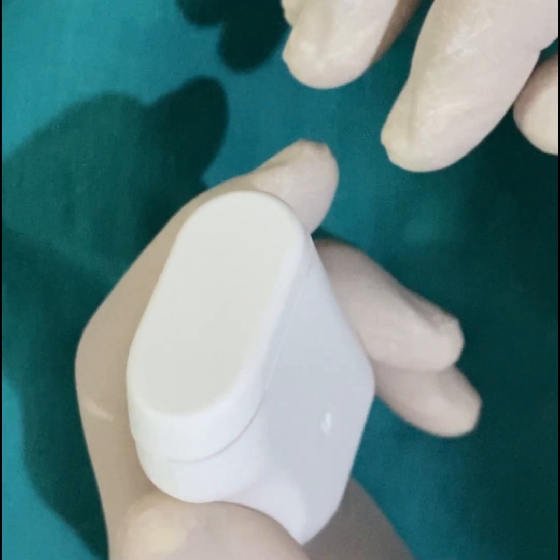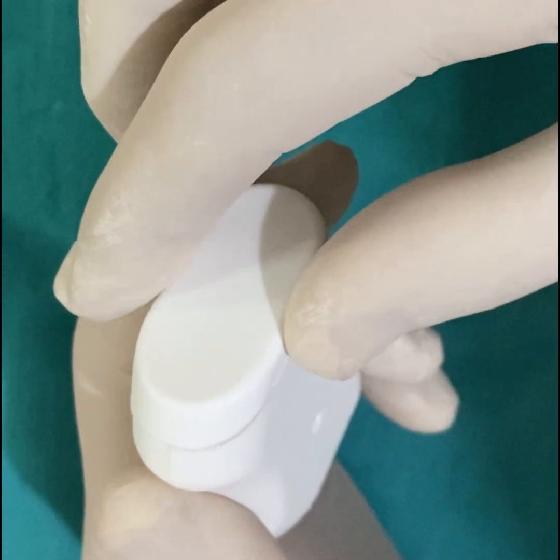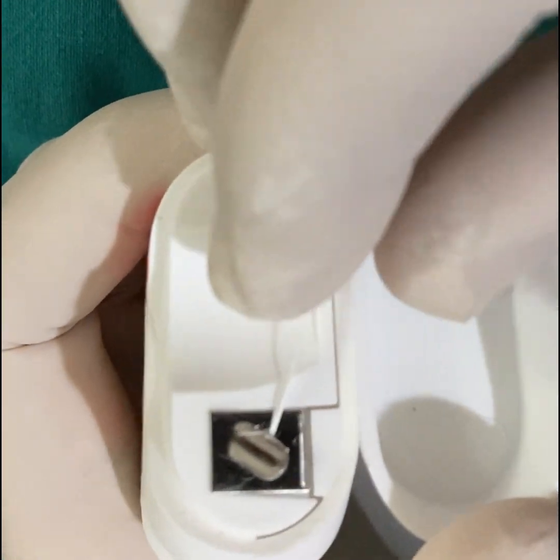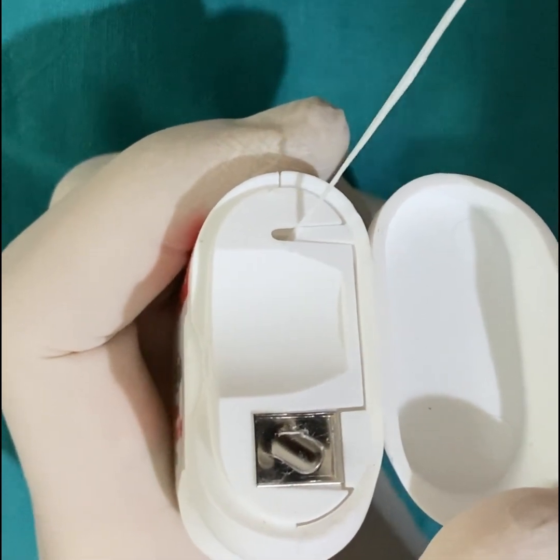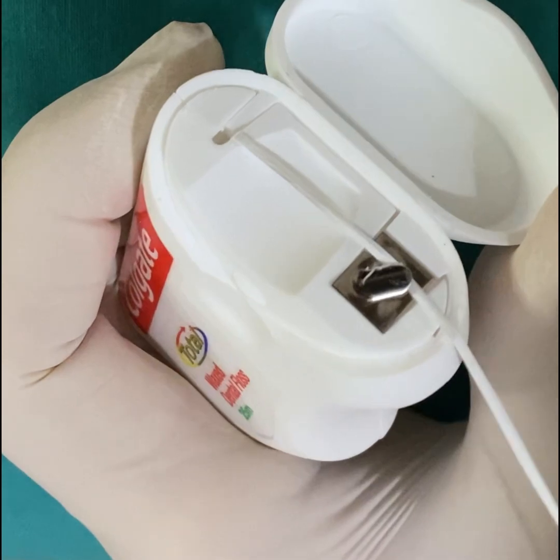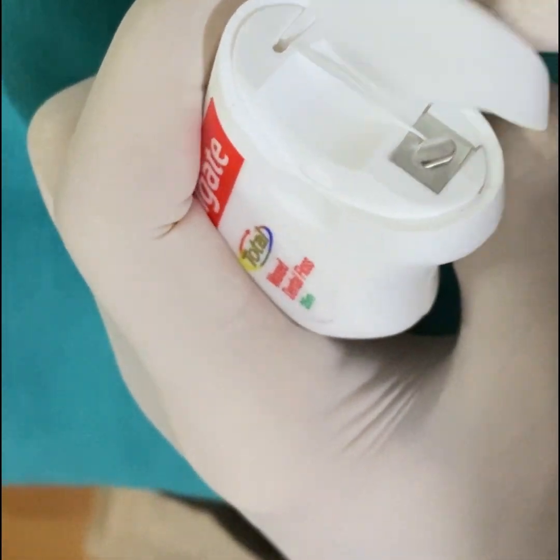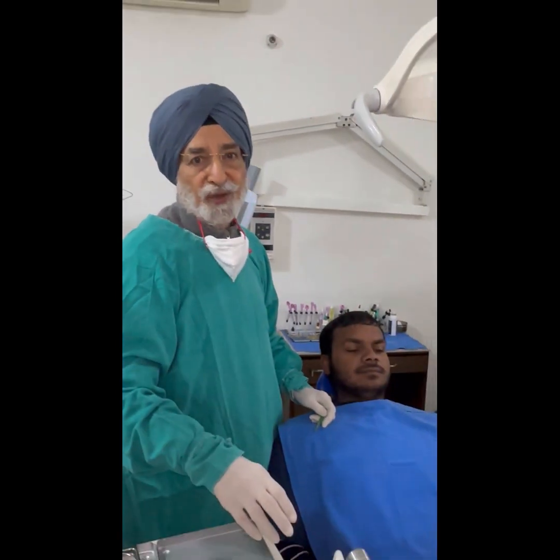The floss is available in the market in the form of a reel packed in a container like this, which can open. It has a thread which can be stretched like this to a convenient length, and it also has a cutter so that it can be cut, and for packing it can be just pressed and closed. Now I will demonstrate to you how to use the floss.